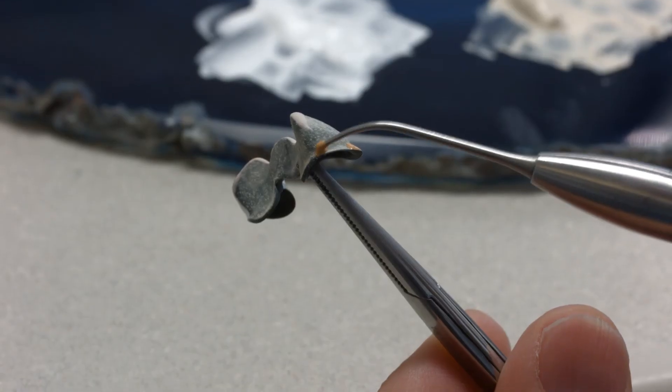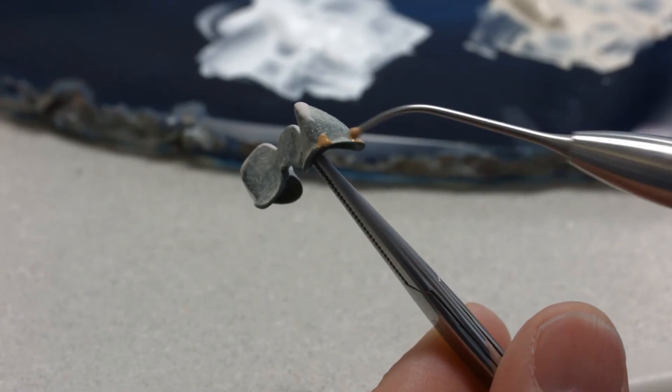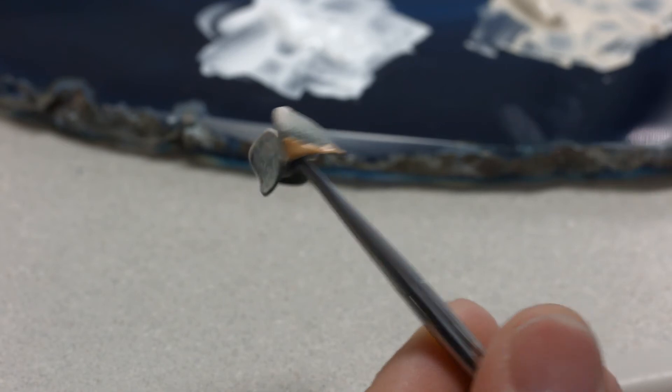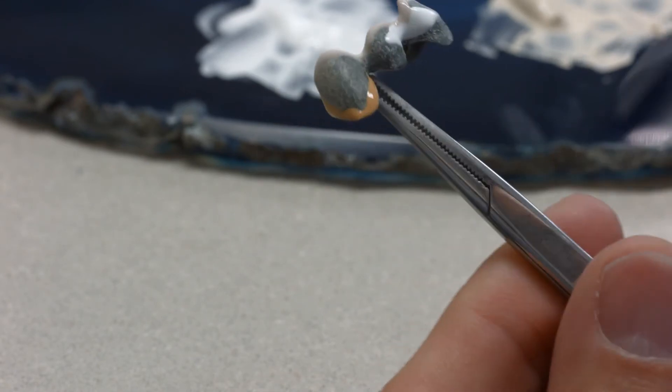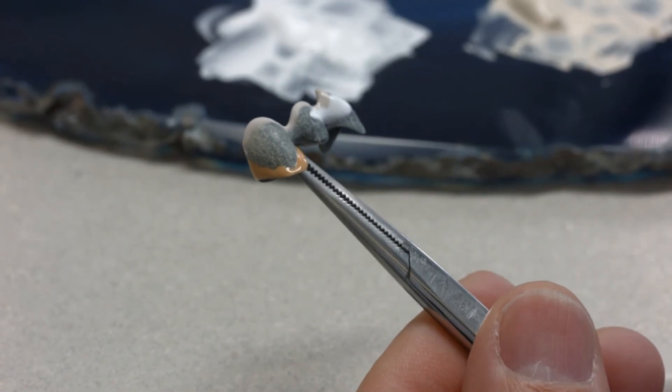Brushes or ball-shaped ceramic instruments are particularly suitable for this purpose. It's important to ensure that the material is applied evenly and uniformly.